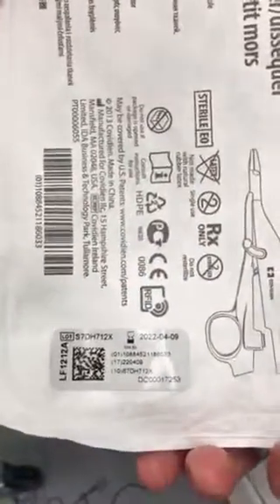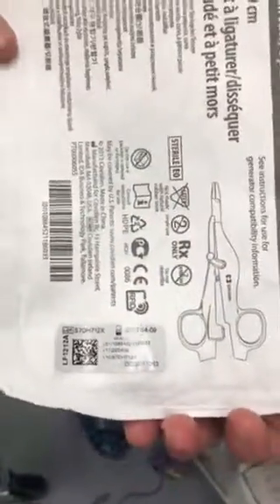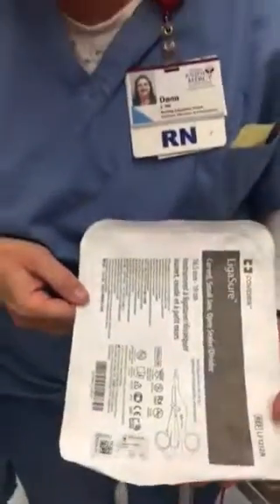The other item you need to be very careful with is down here. On any piece of equipment we use in the OR, there is always a use by or an expiration date. And I would caution you, since we do not use these very often, if there are these handles stored in our supply rooms, please verify the expiration date before you put it onto the operating field.